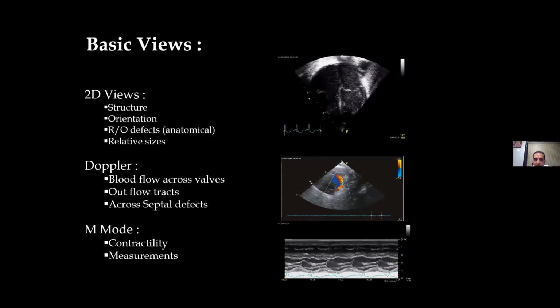But if in that 3-day-old preterm baby, you start seeing LA and LV dilated in an apical 4-chamber view, then you start thinking that something is increasing the size of LV and LA. The most common cause is volume overload because of a hemodynamically significant PDA. So that's how you make yourself oriented for various diseases.